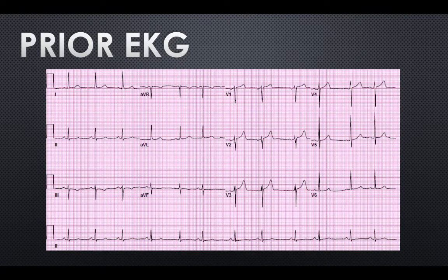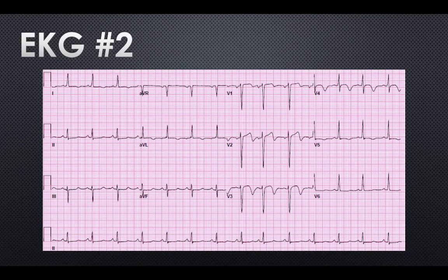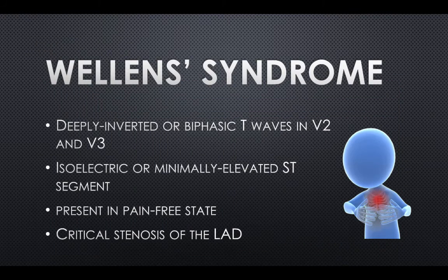So that's definitely true. Fortunately, this patient had a previous EKG. So let's compare this one to the abnormal one we see now. And yeah, I'd definitely say that's different than before. So let's take a look again back at the EKG on this visit. I say this looks pretty Wellens-like. So you're referring to the biphasic T waves in V2 through V3, and that's definitely true.